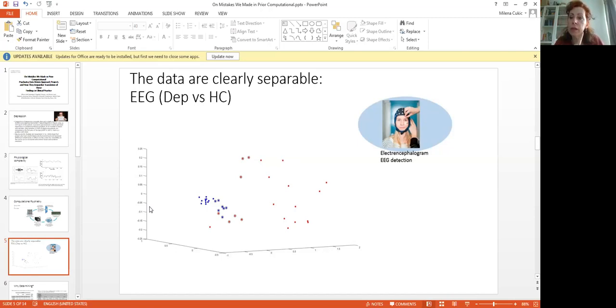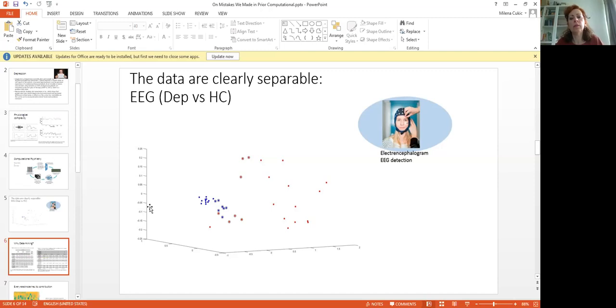If you characterize that signal with nonlinear measures, which are more accurate than standard classical ones, you can describe more realistically the characteristics of the human brain system or any complex dynamic system, because our systems are highly nonlinear, non-stationary, and noisy. So it is pretty hard to describe them appropriately with classical measures.